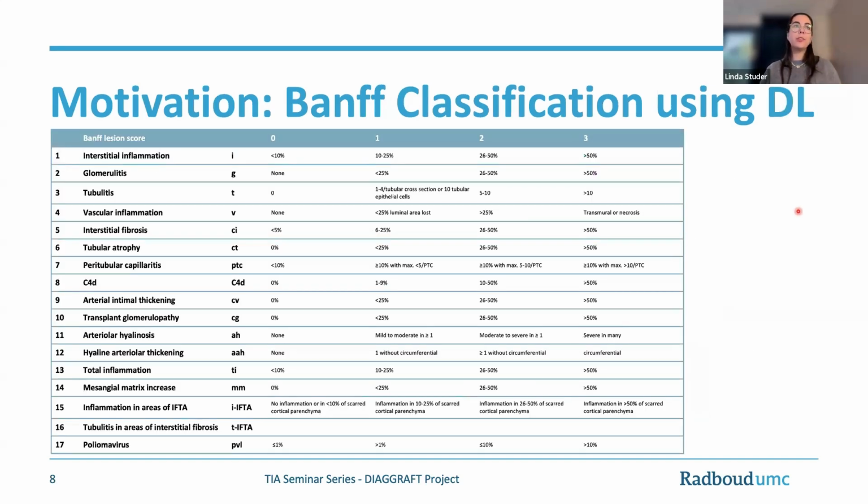Now, just to go back briefly to our table. What we are addressing here is inflammation. These are the things highlighted in blue. And then the factors that we can now address with the segmentation project are shaded in blue. So we cover, I would say, about half of the factors.